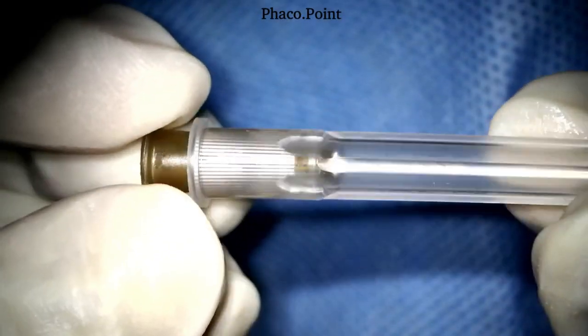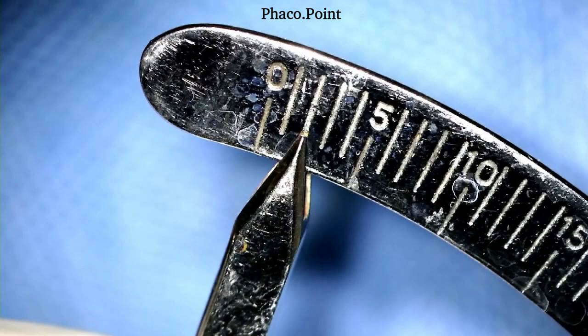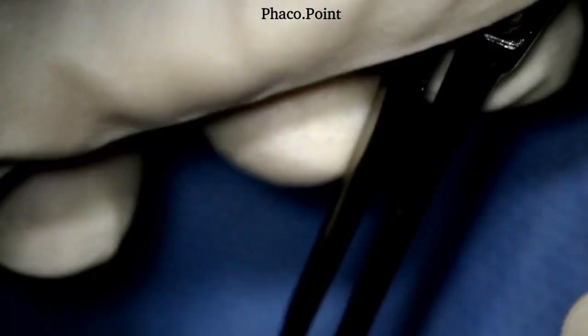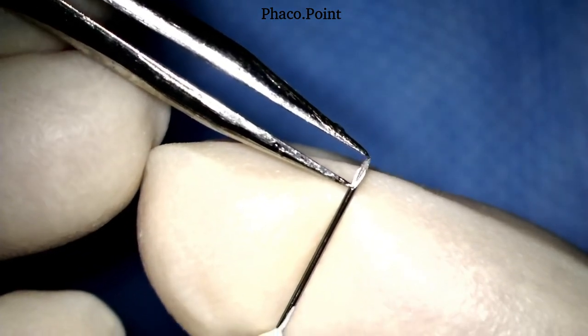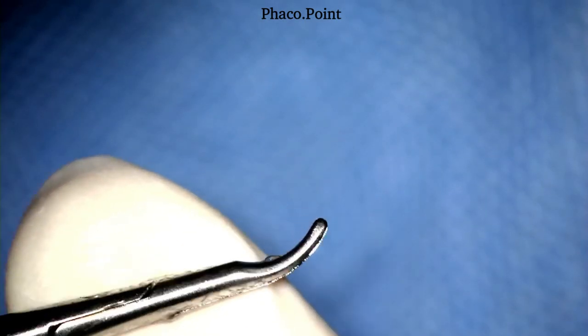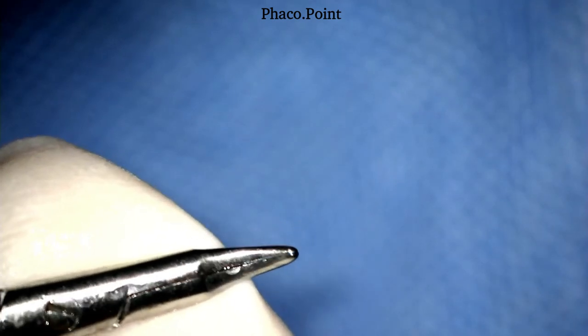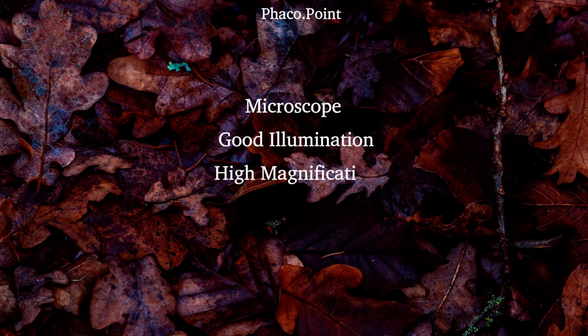A 26-gauge needle is taken and fitted to the shaft of the holder. It is uncapped and now we are ready to create the cystitome. The bevel of the 26-gauge needle is actually two millimeters long — you need to be aware of this fact. We next need to ensure that the needle holder used to create the bend at the tip is not faulty; it needs to have a perfect apposition on either side. Under direct visualization of the microscope, using high magnification, good illumination, and a perfect focus of the tip, we now proceed.